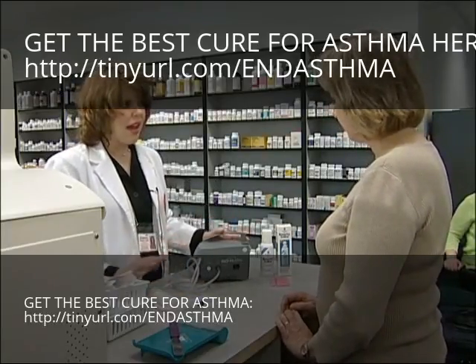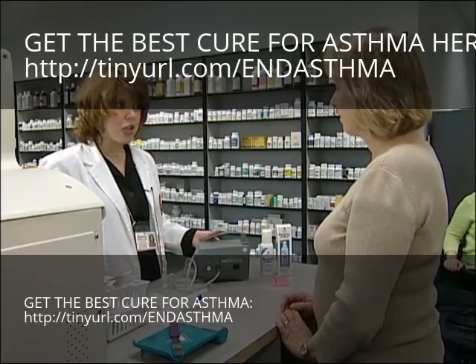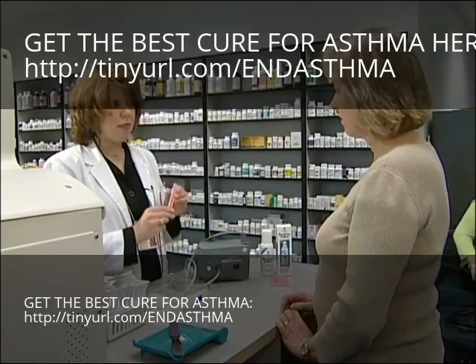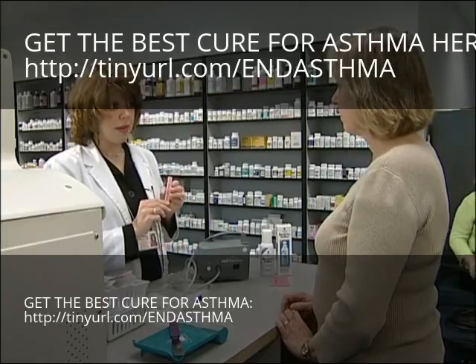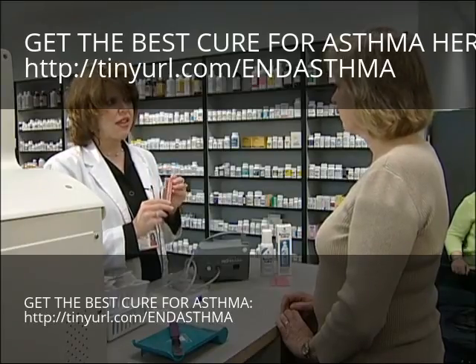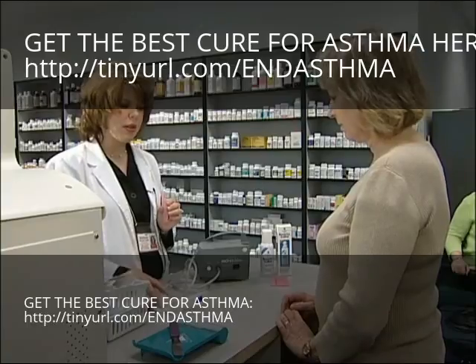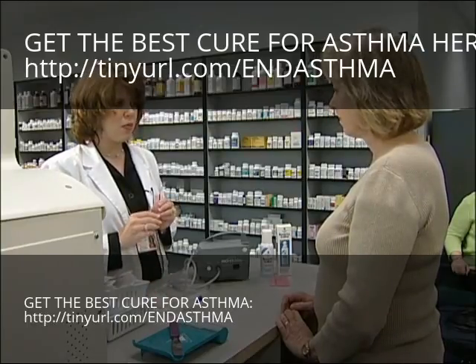Once you have that connected, your nebulizer is ready for use. You just have to put your medication into the chamber. Your doctor has prescribed a pre-diluted, pre-mixed medication that comes in what we call nebules. This is very simple to use — you just open this medication, put it into the chamber, and you're ready to use your medication.